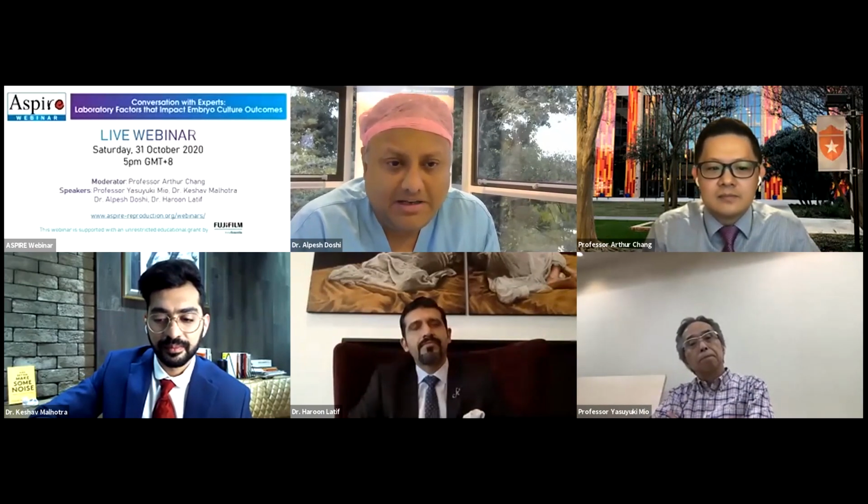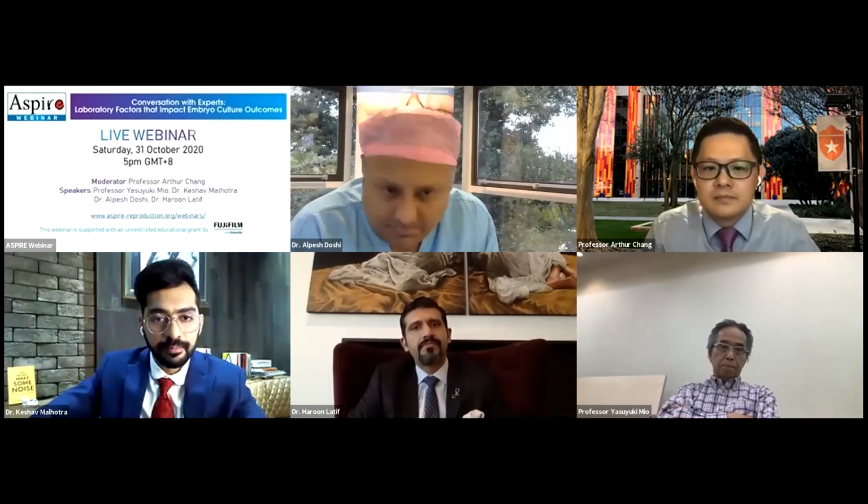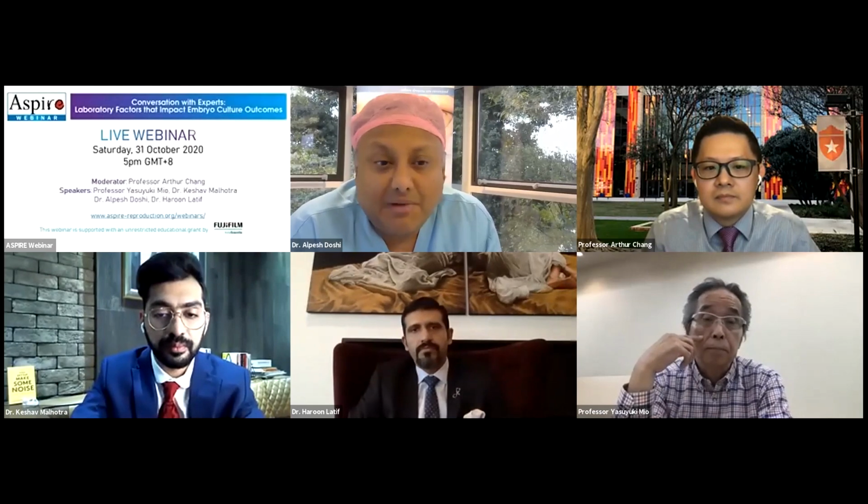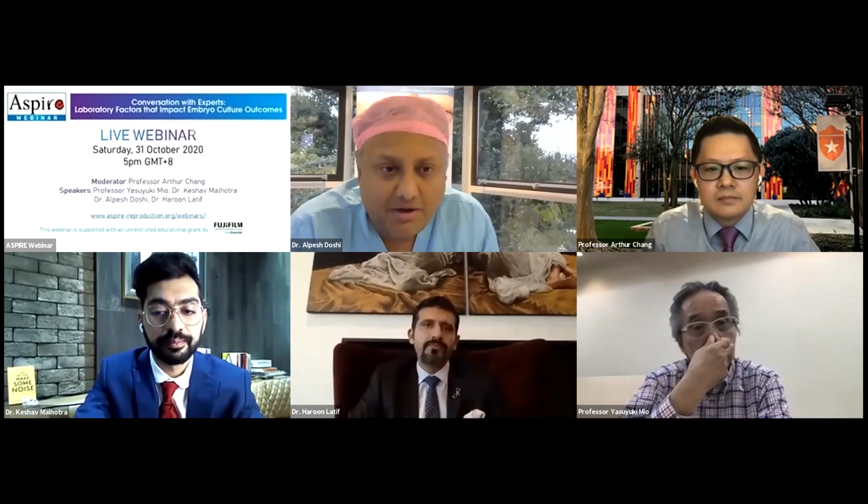For the purpose of biopsy, it is always recommended that you have more trophectoderm cells. So early blastocysts, anything which is grade 1, should not be biopsied, and we should wait to day 6 before we biopsy. It is important to have a nice cohesive trophectoderm forming before you take the biopsy. Otherwise, if the embryo is very early in its blastocoel development, if the blastocoel cavity is less than 50%, then the embryo will not re-expand post-biopsy. So in my experience, it's best to wait till day 6 before you biopsy these embryos.